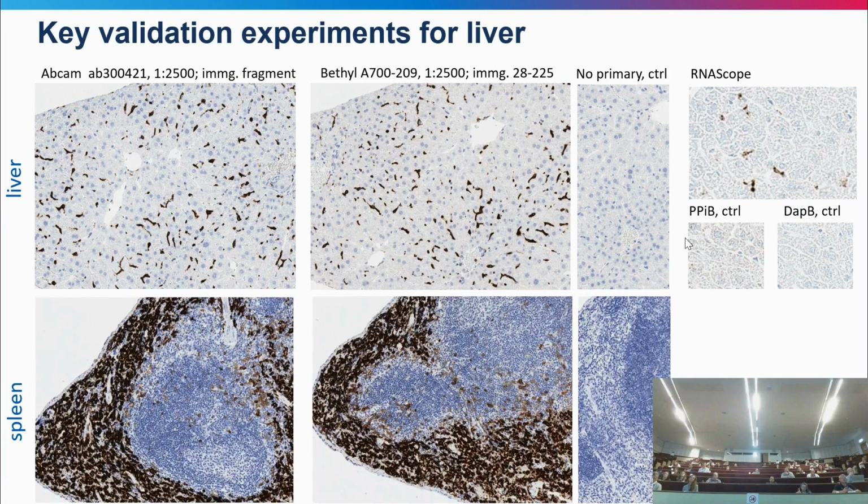So I wish people would publish something like this, and then you don't need to be an antibody expert or a pathologist to appreciate the level of the validation, and you would really know what to do next, whether this antibody is validated or not. In fact, the antibodies that I showed to you were validated by high school teachers. This is the educational program that Regeneron provides. High school teachers come to us and spend 2 weeks with us, and this is one of the projects that they like to do. They like to validate the antibody. They take their experience and their report and go to the students and show them how to validate the antibody and how a pharmaceutical company is working.